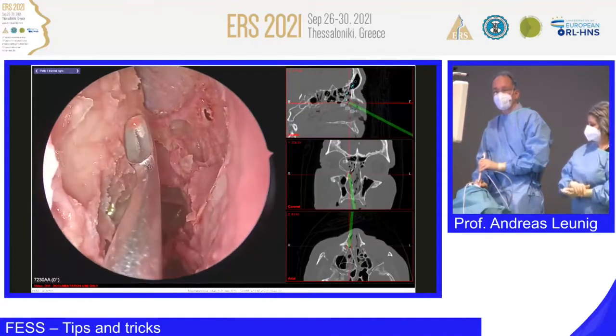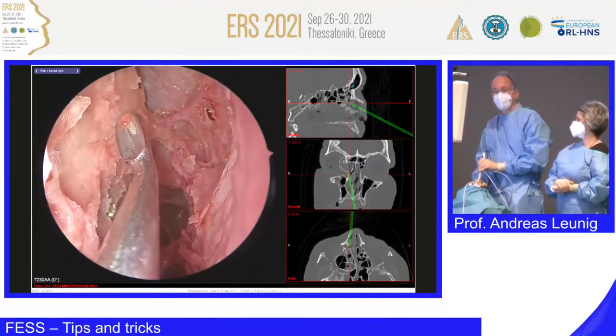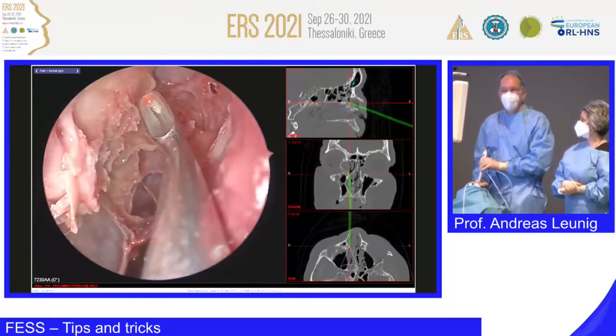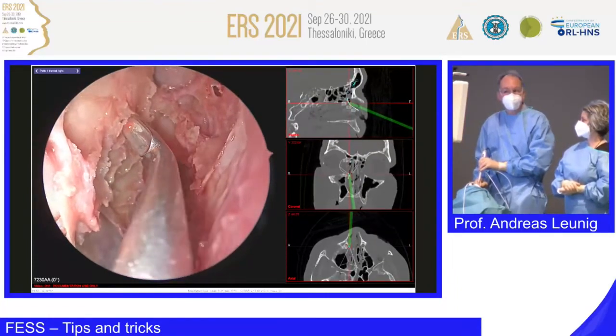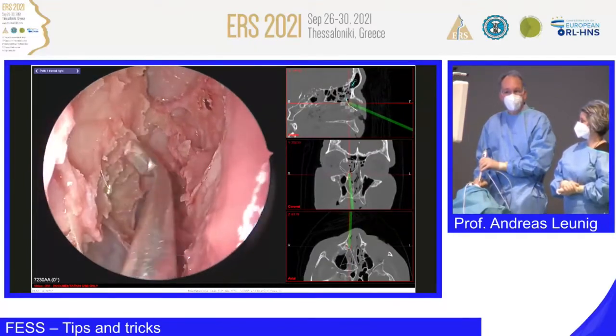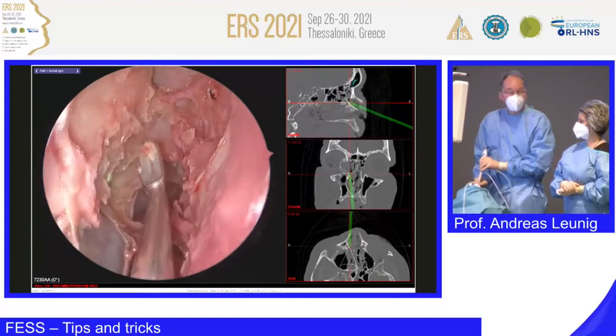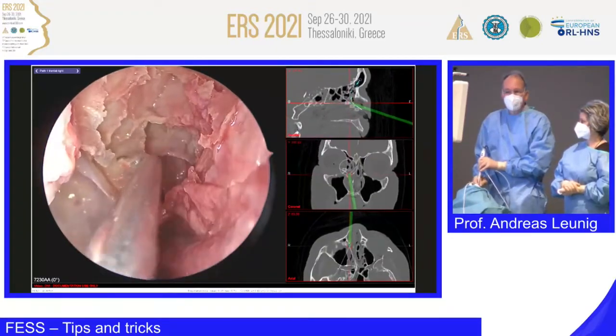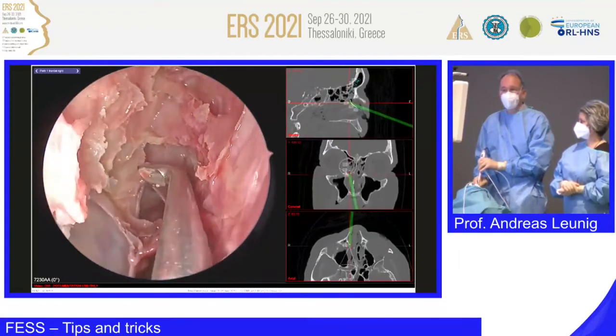And it's the same for the lamina papyracea. I can't ask you a question exactly because it depends. You will have sometimes a dehiscence in the bony protection here to the orbit in the lamina papyracea, but I don't know where. So pay attention to the whole area and as well when you come to the apex of the orbit.